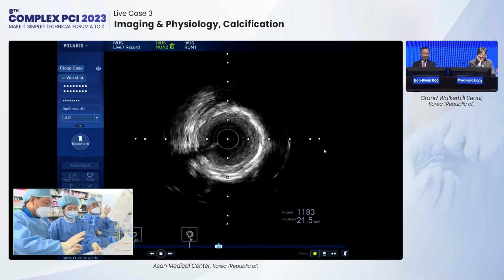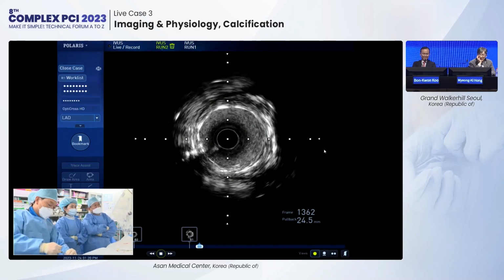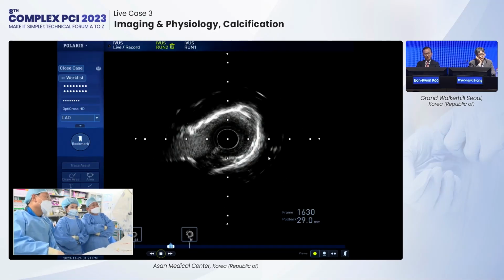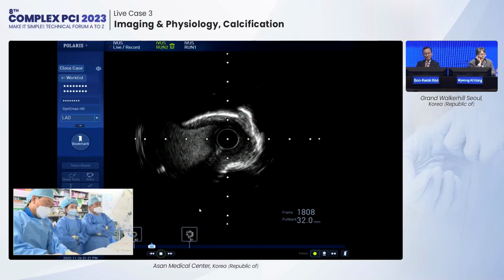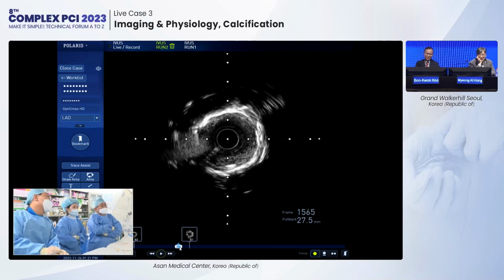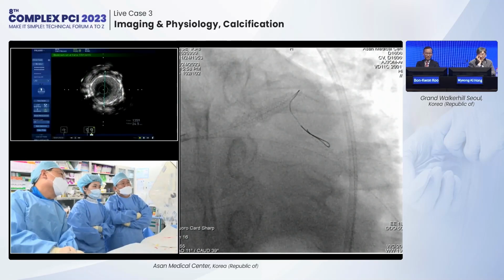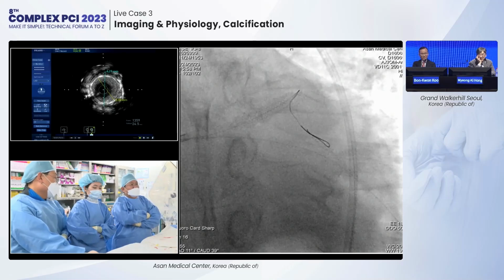But compared to the vessel size, the stent looks small, only 3.0, although it is expanded. Some neointimal hyperplasia. This is actually the ostium of LAD. We already performed the LAD FFR before. LAD FFR is 0.81. So the FFR value is above the ischemic threshold, but the stent doesn't look optimally implanted. This is another point I want to show. Even so, at this moment I don't like to touch the LAD anymore.